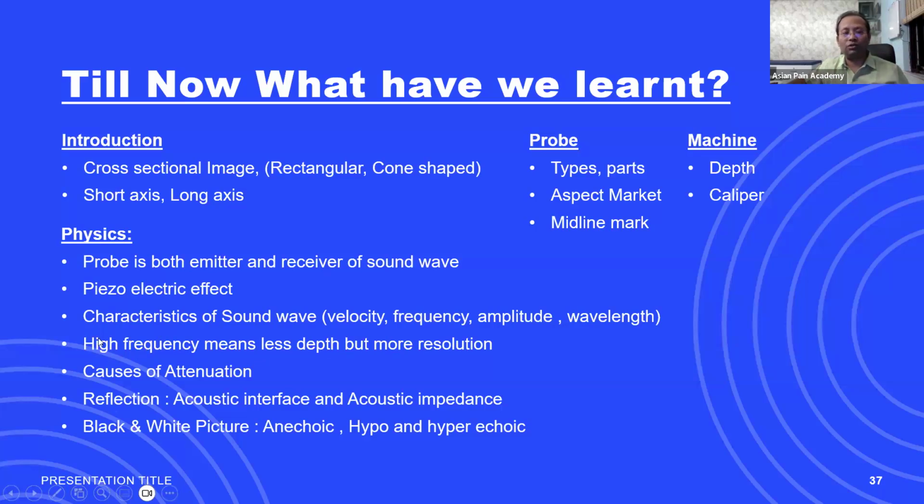The opposite is also true. Less frequency means more depth but less resolution. Causes of attenuation, we have understood why the attenuation occurs: reflection, refraction, absorption, all these things. And reflection, why does it occur? Acoustic interface and acoustic impedance.